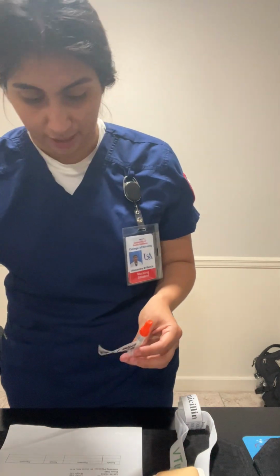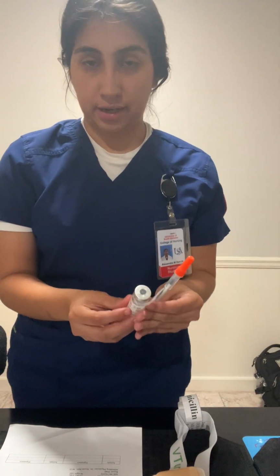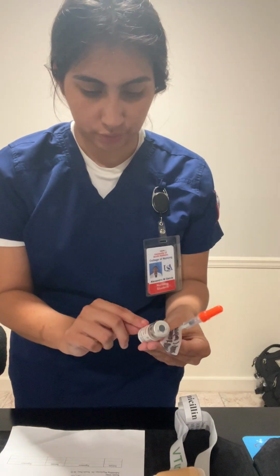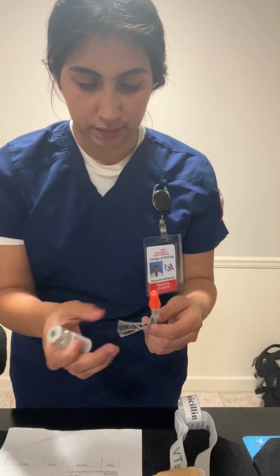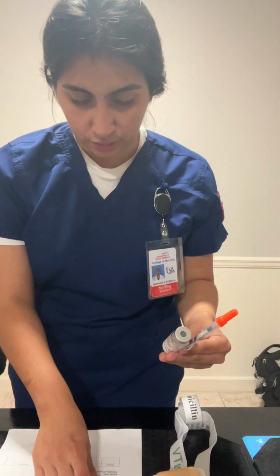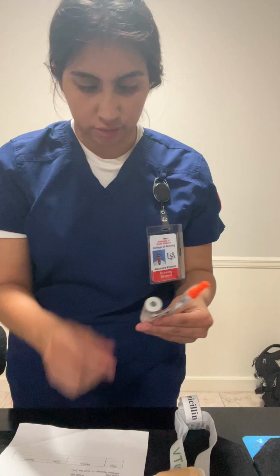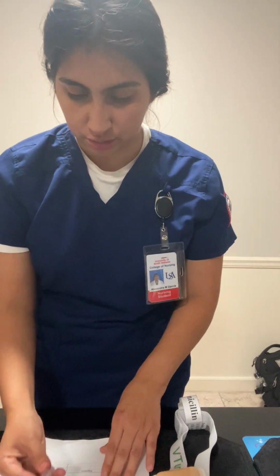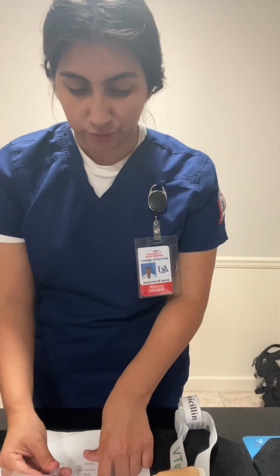I'm going to bring my vial and my syringe and compare it to my MAR: Novolin R regular insulin. And now the right dose. I'm going to compare it with the label on my syringe, which is 10 units.